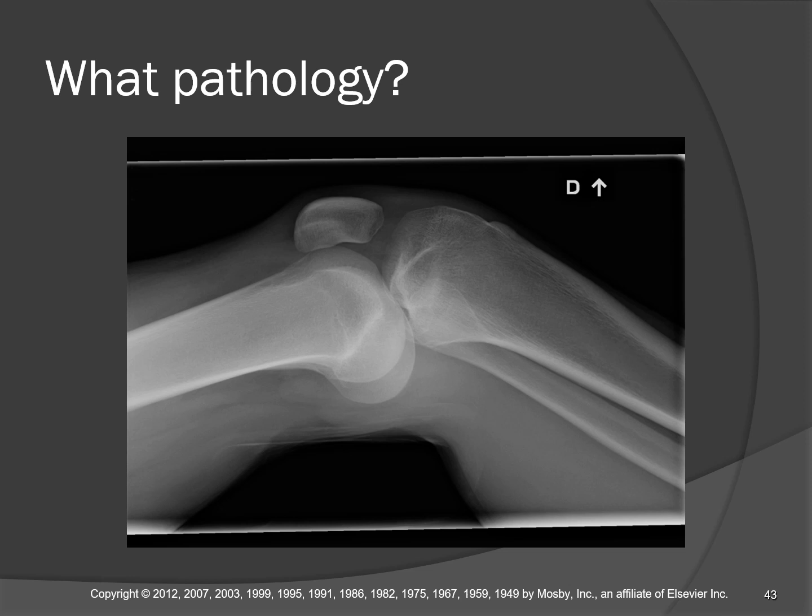And so the distal anatomy between the femur and the tibia is the tibia. It looks like the tibia has displaced or dislocated anteriorly. So this is an anterior dislocation of the knee. And someone will say, well, why don't we say that it's a posterior dislocation of the distal femur? Well, because that's not the nomenclature rule. The way that we name this is always the distal anatomy seems to be the one that is shifted.